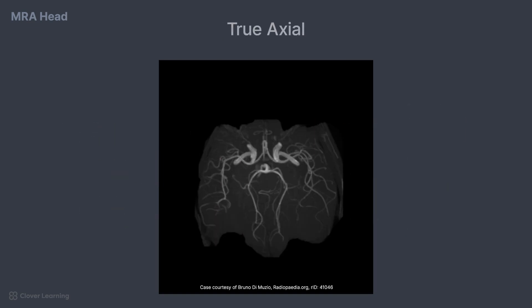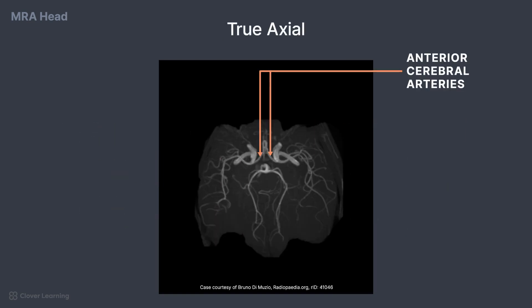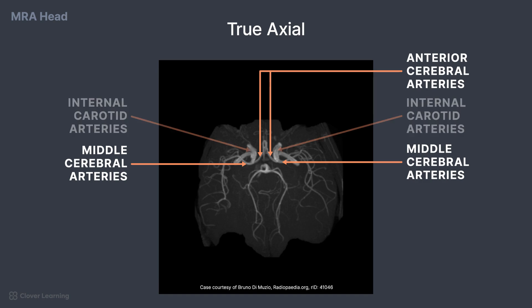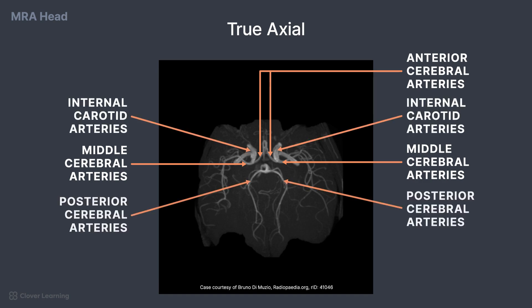For the true axial view, the anterior cerebral arteries, middle cerebral arteries, and internal carotid arteries are seen. For the posterior circulation, the posterior cerebral arteries and basilar artery are easily identified.